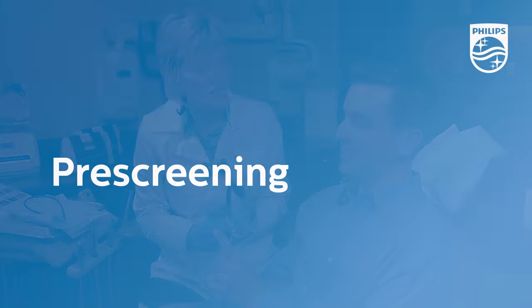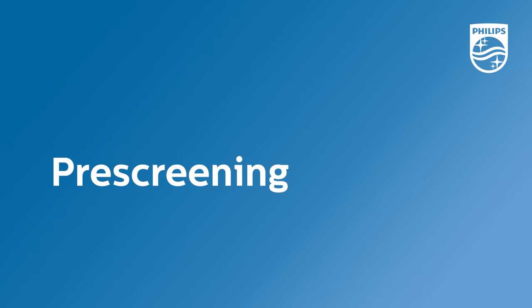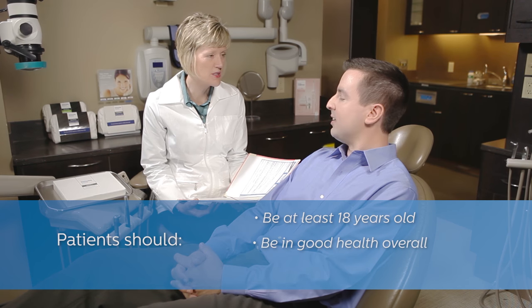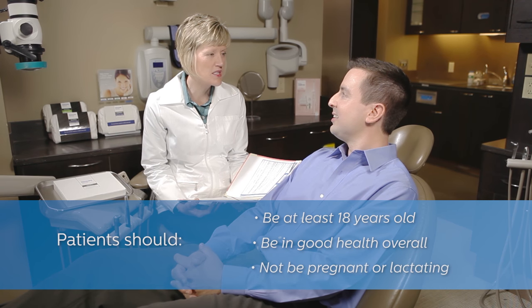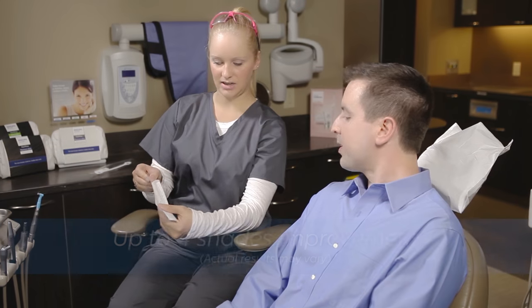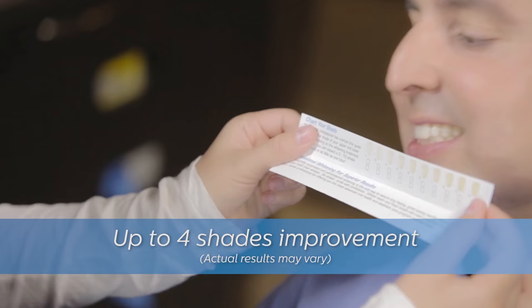Before beginning, it's important to determine if the patient is a candidate for Quick Pro whitening varnish. We recommend that they are at least 18 years of age and in generally good oral condition. Pregnant or lactating mothers or those with a serious illness should consult their medical doctor prior to the treatment. Like all whitening procedures, results may vary from patient to patient.